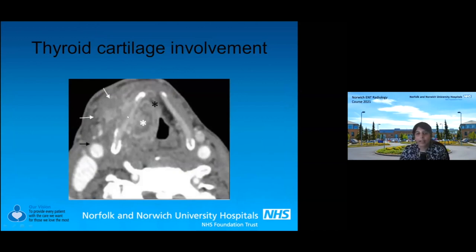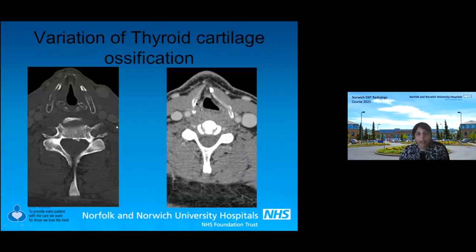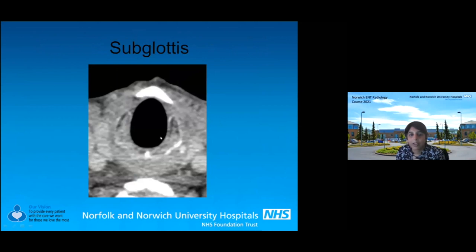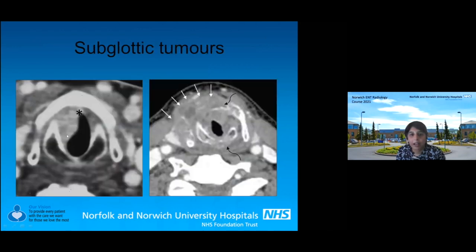Thyroid cartilage involvement is not always this simple. This is a large laryngeal tumor that's eroded through the thyroid cartilage into the strap muscles. They can have variable ossification, and you can get odd variations and bending of the thyroid cartilage, so be aware of variations and carefully inspect the inside and outside soft tissues when looking at the thyroid cartilage. For the subglottis, there should be no abnormal soft tissue — the cricoid should be pristine with no irregular areas. If you see anything asymmetrical, be worried about tumor, because these patients present late. Unfortunately, this is usually how patients present: circumferential abnormal soft tissue extending through the cartilages into the strap muscles.